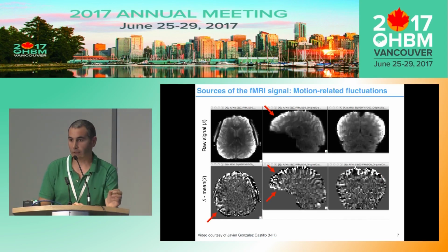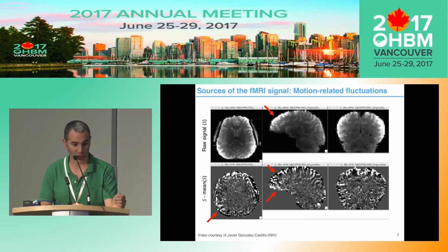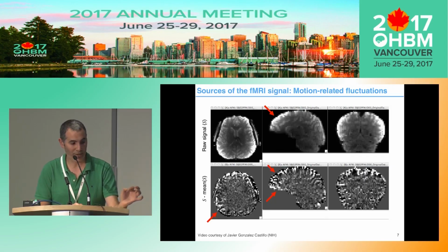If that motion is correlated with the timing of the task, it can introduce signal changes that could create spurious correlations between voxels. This is not seen in the images that we collect, but if we look at the signal percentage, then the signal changes due to motion are very clear, especially at the edges of the brain.